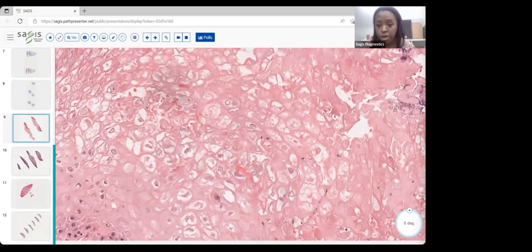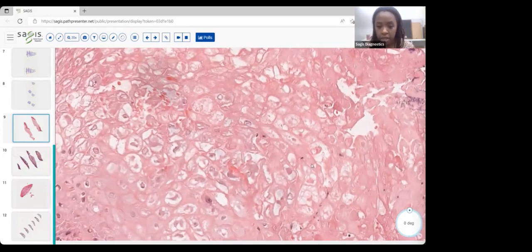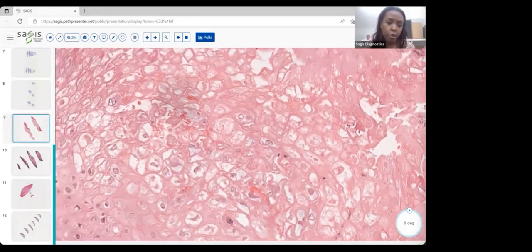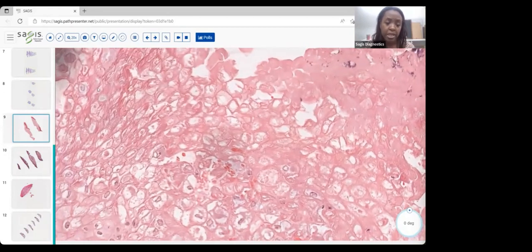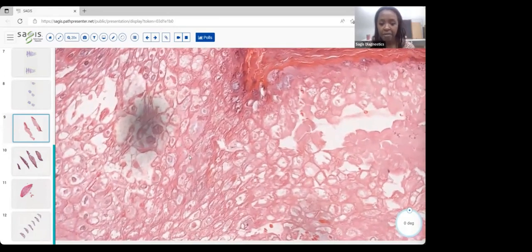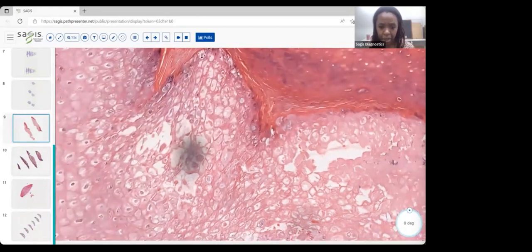There is essentially intraepidermal edema here. There's a clearness to them intracytoplasmically. So we have some intracellular edema, as well as what we had noticed before is that we have some pretty significant spacing between the keratinocytes, right? So we had some spongiosis out toward the edges, and now we just have frank vesiculation where that intraepidermal edema is expanding. Okay, so it's just essentially edema everywhere.